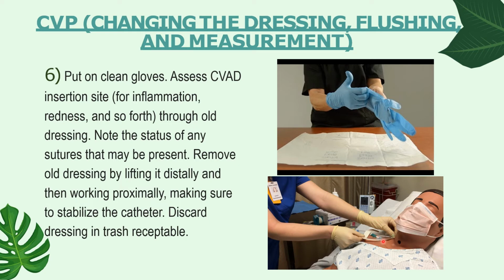Through the old dressing, you have to check over it. And then you have to note the status of any sutures that may be present. Remove the old dressing by lifting it distally and then working proximally. You have to make sure to stabilize the catheter, and then you can discard the dressing in a trash receptacle.